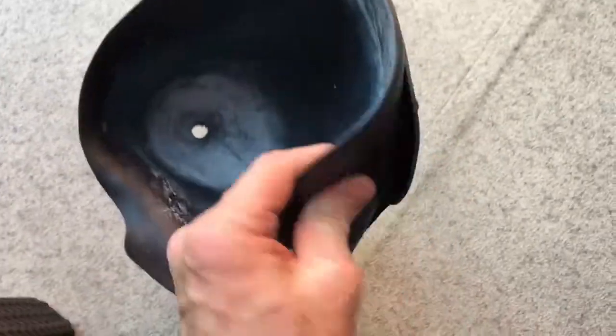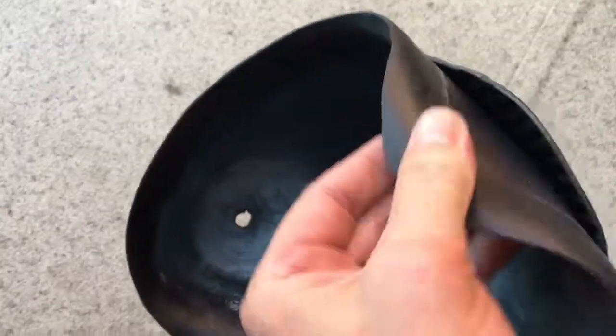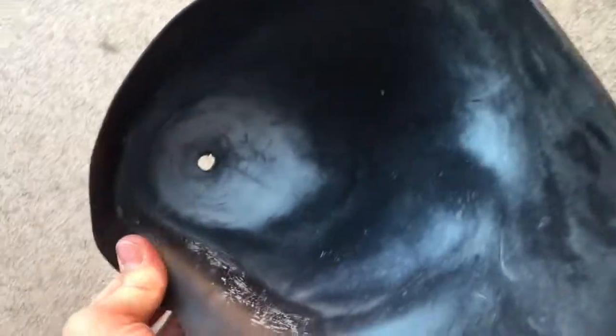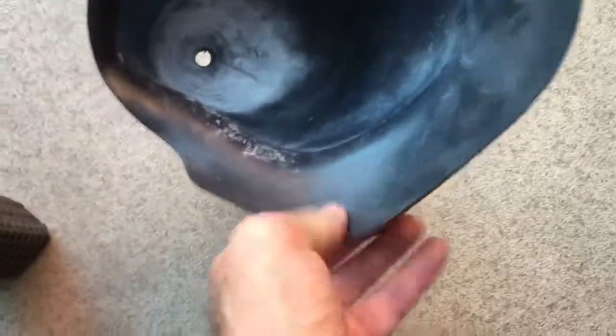The biggest thing about this new socket design is this here. Check that out — that is a silicon liner. So instead of the clear plastic, this stuff is silicon, and look how flexible that is. It is awesome, especially when you get in around the groin area. It's a game changer for me.